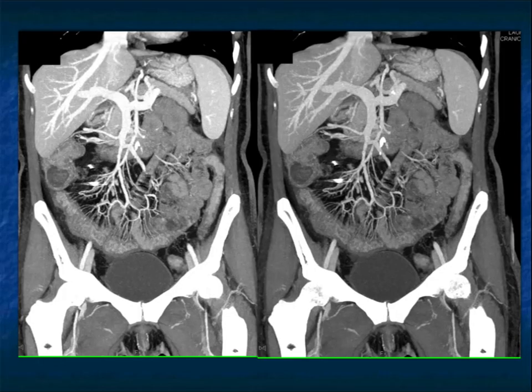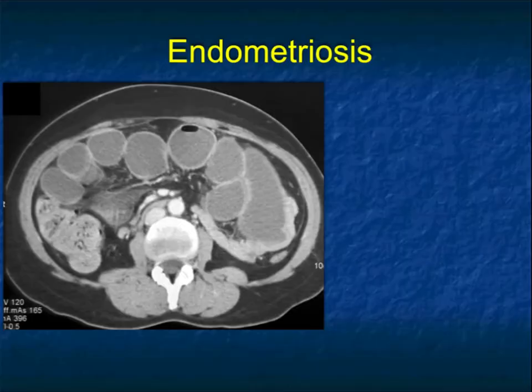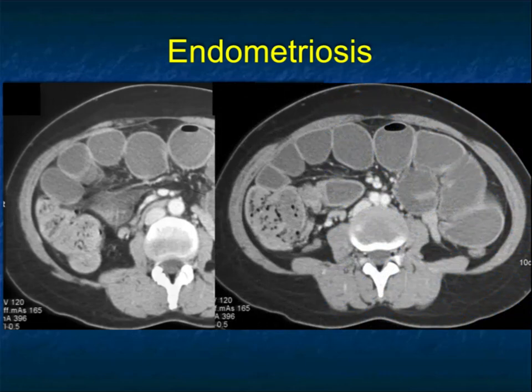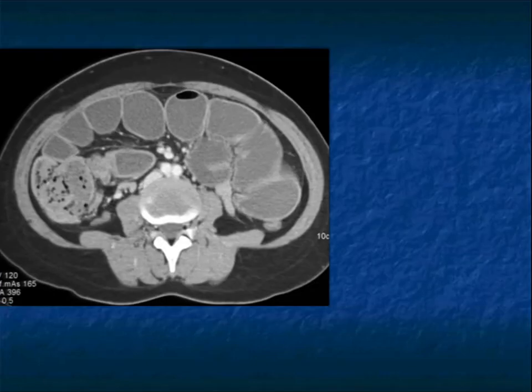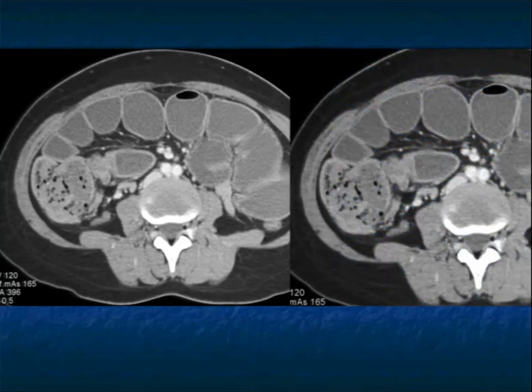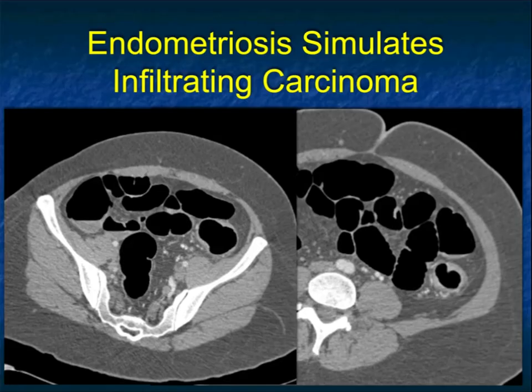Here's another patient with bowel obstruction. It looks like a mass by the terminal ileum — you'd say lymphoma, maybe carcinoma, or even a cecal cancer growing into the terminal ileum. This was an example of implants on the terminal ileum from endometriosis, causing what looked like a tumor. It was causing bowel obstruction, but this was endometriosis.